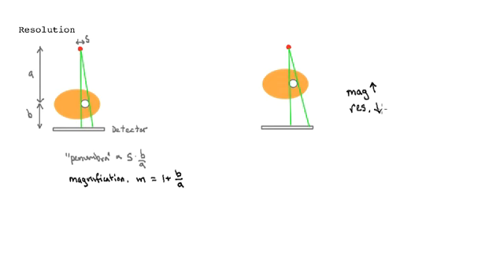Remember back to this image that the resolution is affected also by the size of the source. That's a big factor, and where you have the patient as well. So there are quite a few parameters that affect resolution.